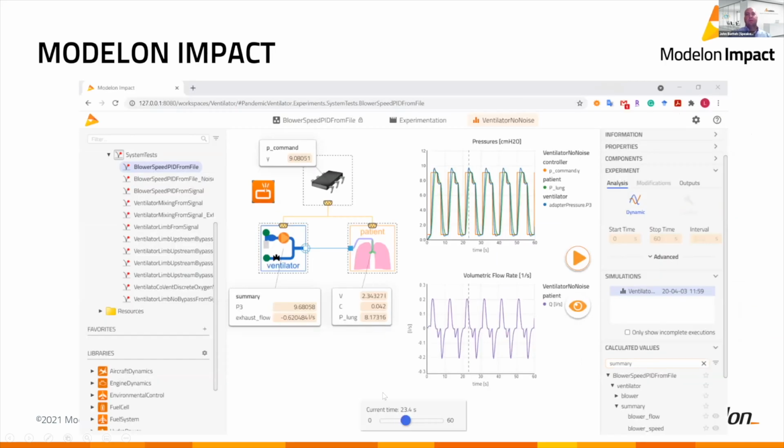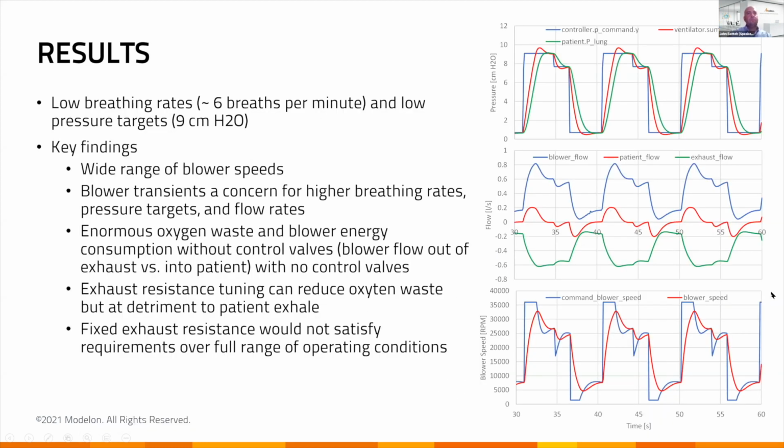And this is the way the model looks in Impact. Here you can see the model. Impact is our modeling platform. It's browser based, so you've got the normal modeling capability and also the ability to annotate your model with graphs and information. So this is how we were running the model, and we had all kinds of results here, but I will show you some extracted results in more detail.